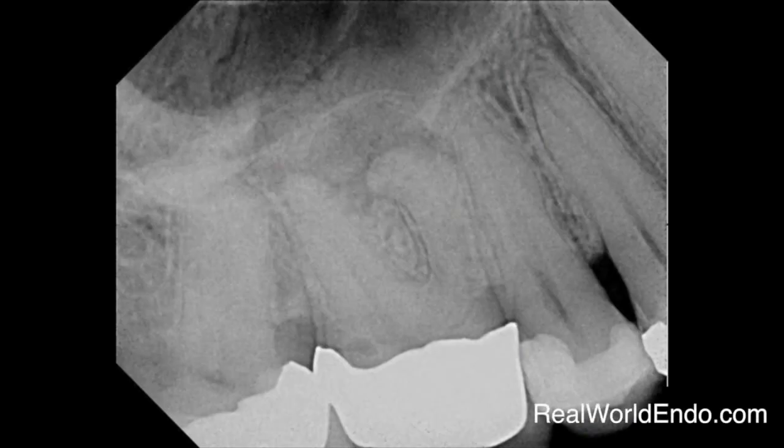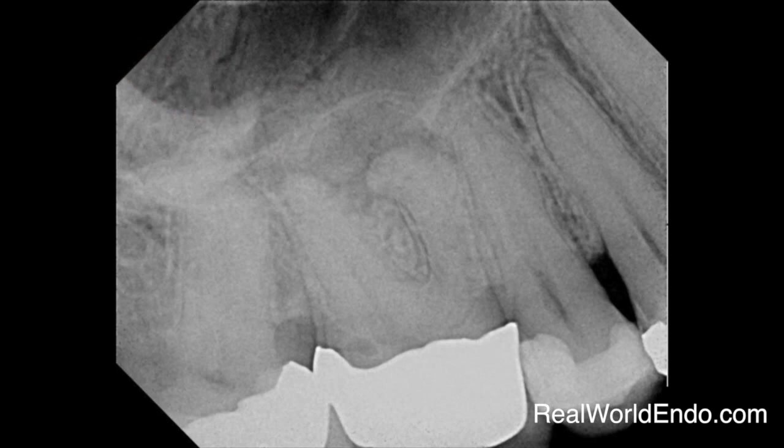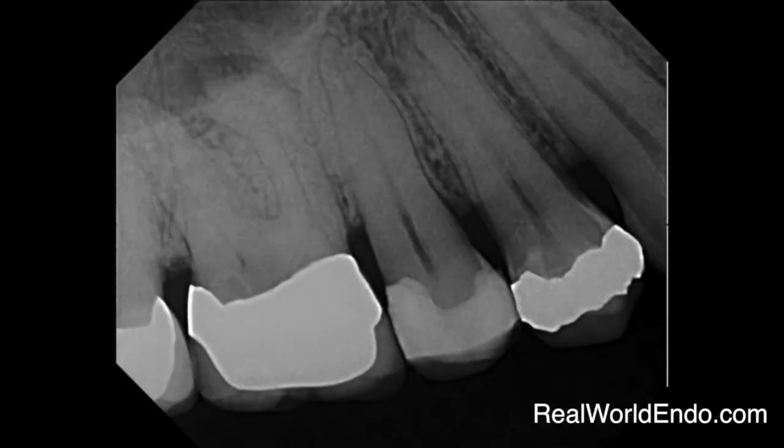Let's do a quick clinical case. We have tooth number three, a maxillary first molar, with some calcification, a necrotic pulp, and an existing crown. There's some potential decay in the distal area and the crown would have to be replaced. There is some curvature, and you can see the calcification in the mesial buccal and the lesion at the apex of the mesial roots.